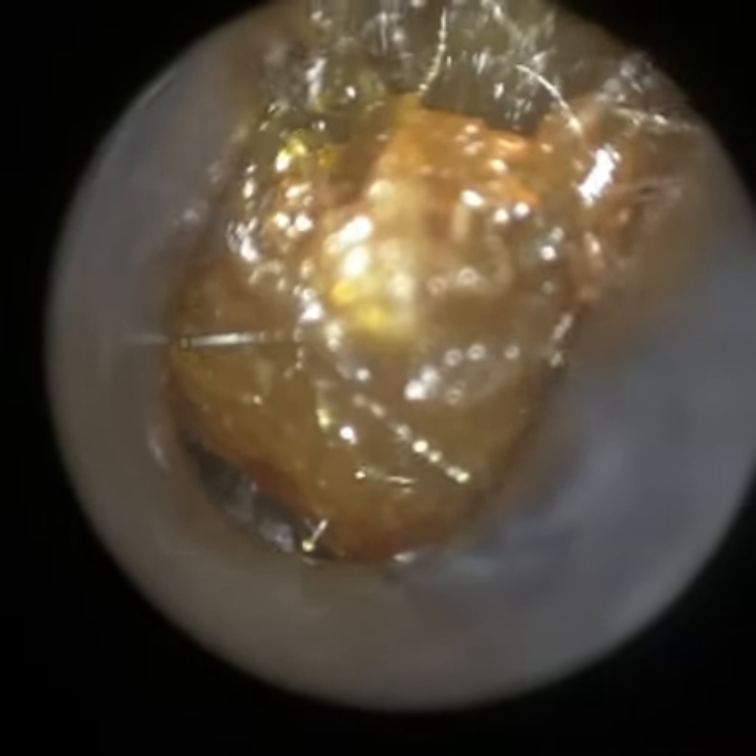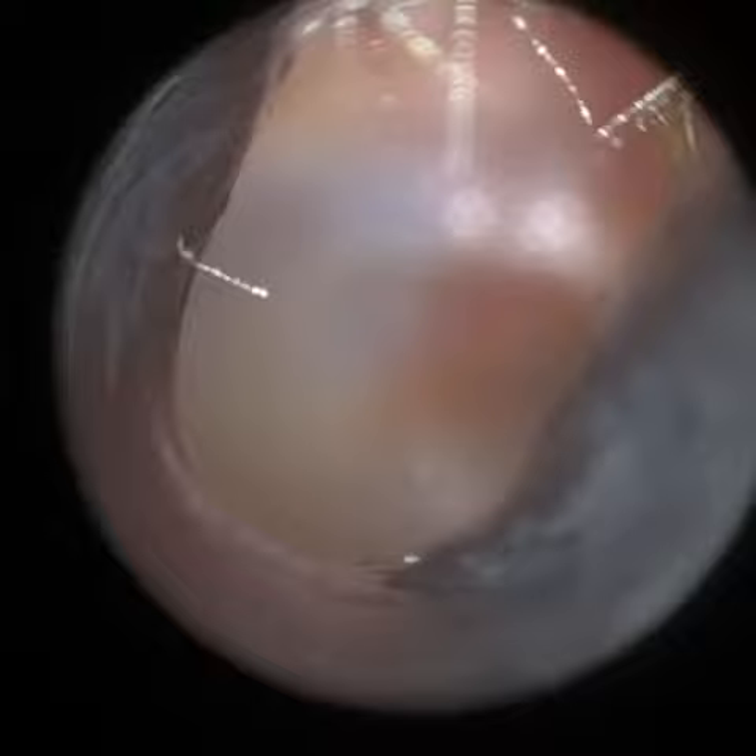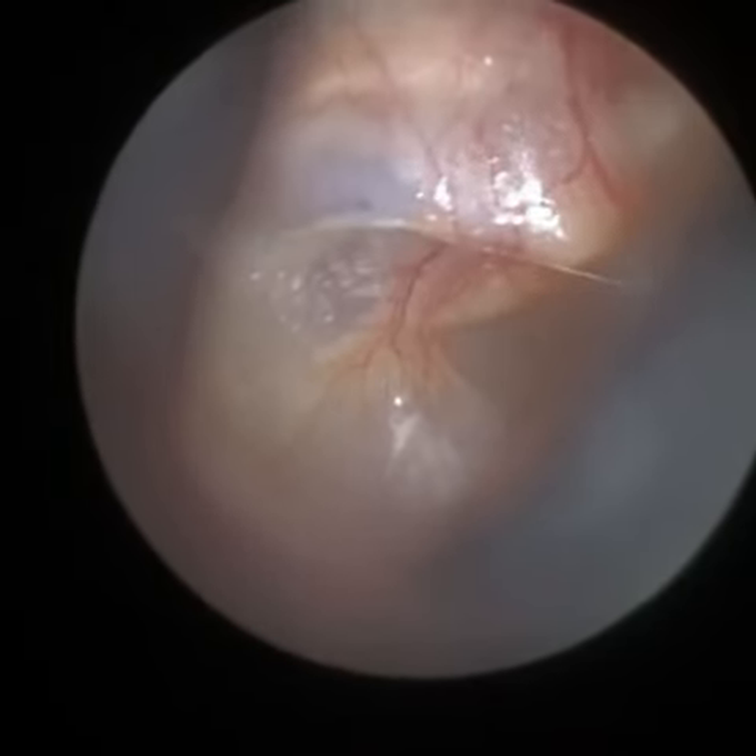These are the ears I feel people would have normally struggled with — especially during our training courses — when using an endoscope with a narrow and bendy ear canal. That's because with an endoscope there's no speculum attachment, so you're having to rely on your ability to stretch and straighten the ear canal. If you don't stretch and straighten the ear canal first and you attempt to perform endoscopic earwax removal, your hands will cross over as you try to insert the instrument and the endoscope simultaneously. So it's a bit of a technique, hence why we've developed the Waxscope, because I feel it's more user-friendly.